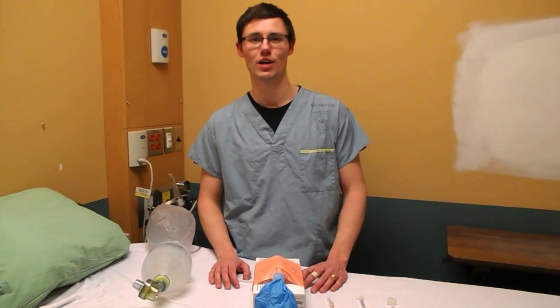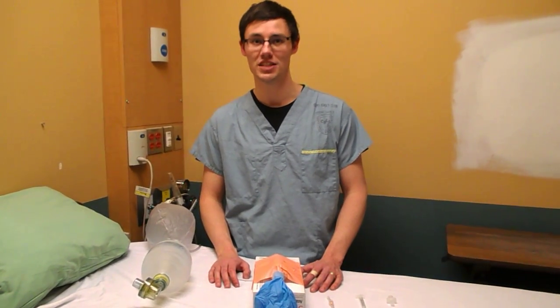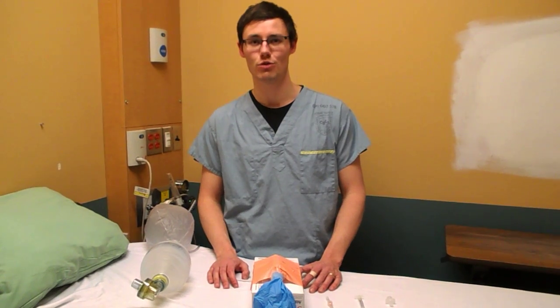Hi guys, it's Chris Vaughan from the SockMob blog. Today I'm going to be showing you how to jet insufflate doing a cricothyroidomy.